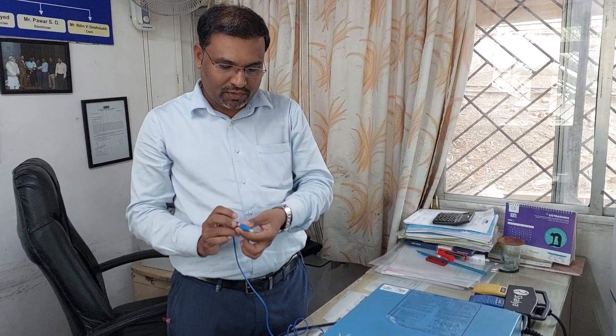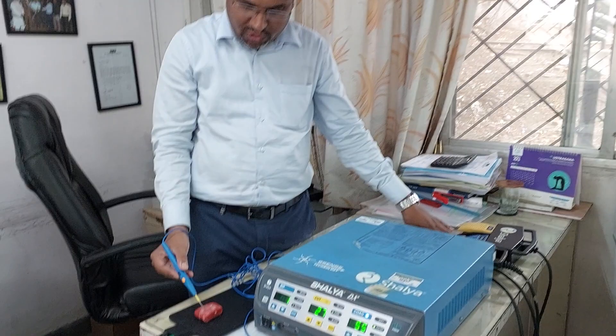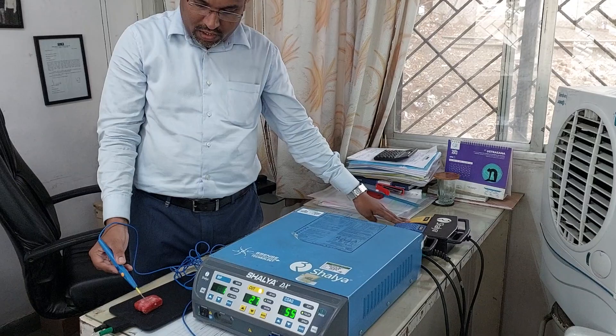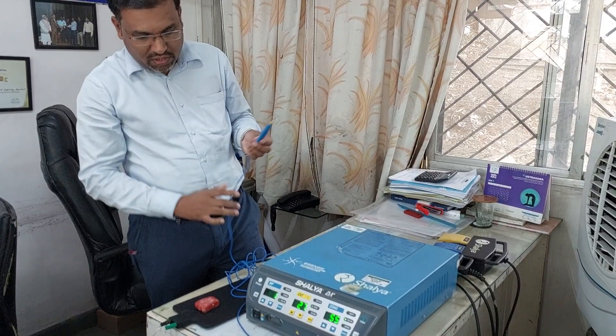Sometimes the doctor doesn't have time to use the hand switches to cut and coag, so they have provided a foot switch. With the foot switch you can also operate the cautery — you can cut or coag. You can observe the sparking when using the foot switch as well.